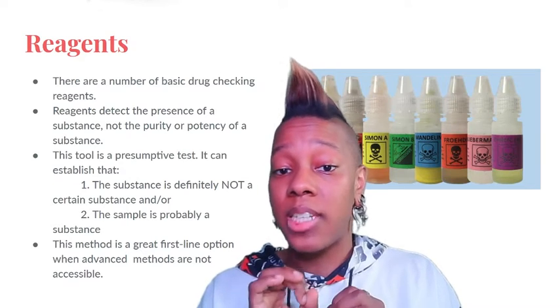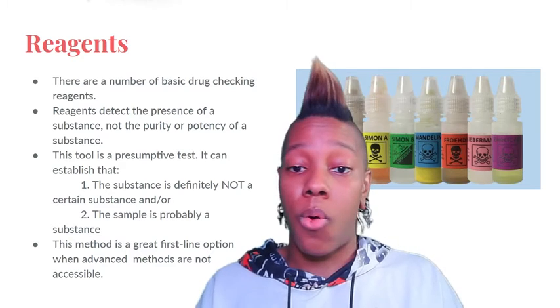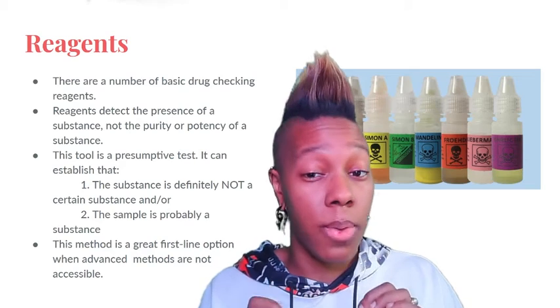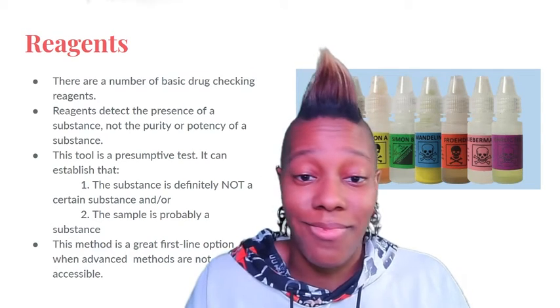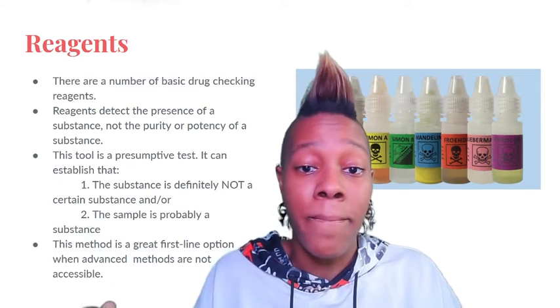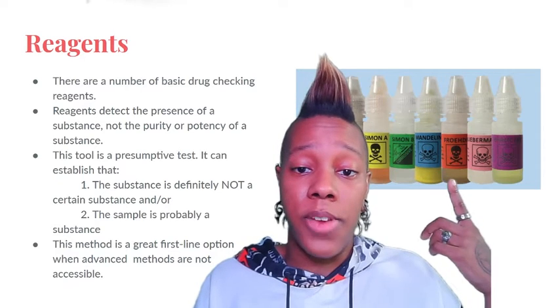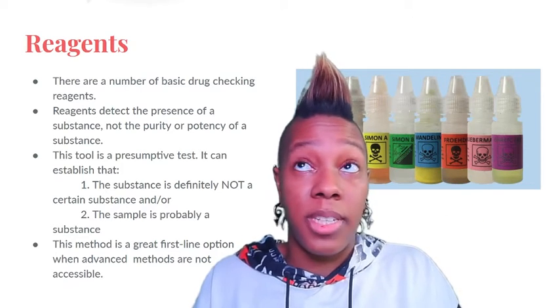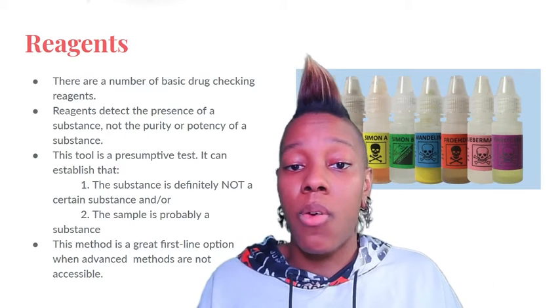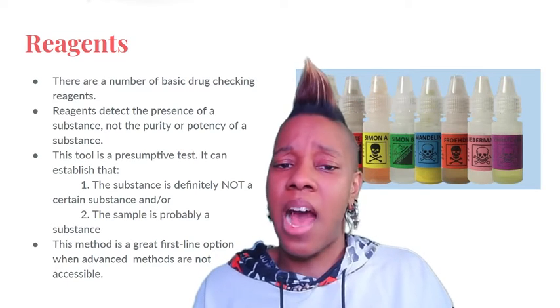There might be a flash of another color, like blue to black, purple to black, a more gray to black, but the end color is black, and it can happen very quickly. If you're in a low light setting, like you're trying to do this in your festival tent, you may not even pick up on that. So there are certain reagents like the Froehde reagent where a benzofuran tests completely different colors, no way to be confused about it. And so that's how we would pick up that sometimes, after doing the 4-panel test, meaning like, this kind of looks like MDMA.